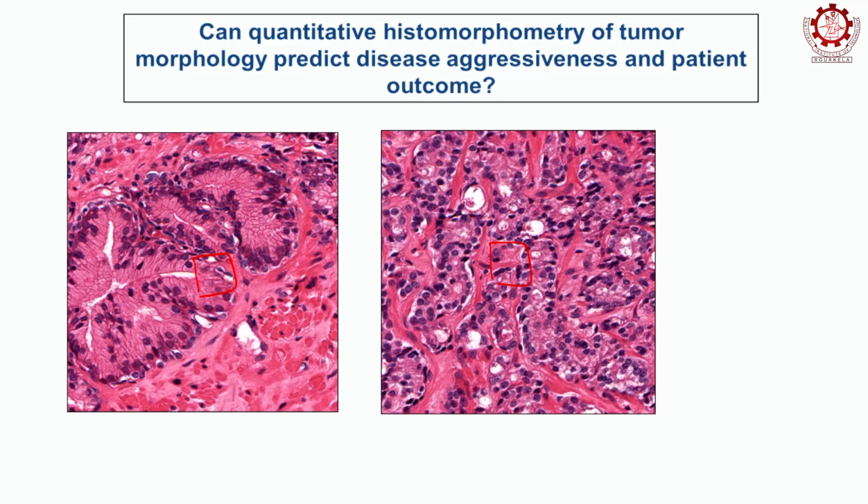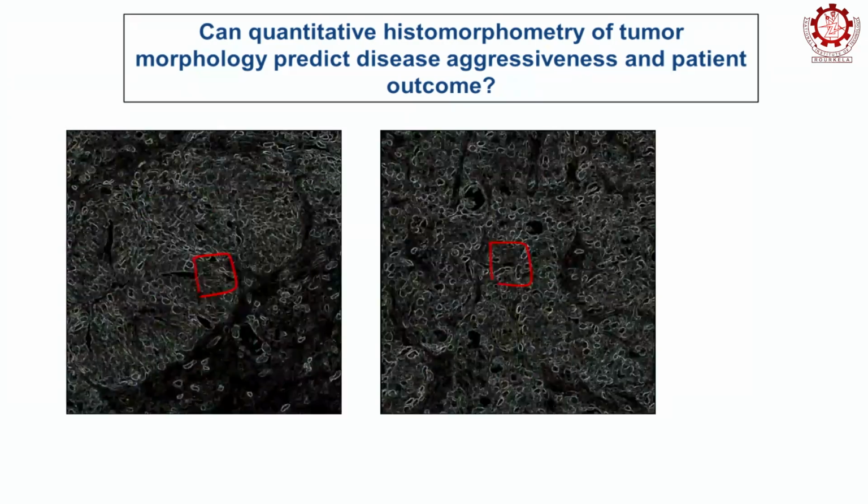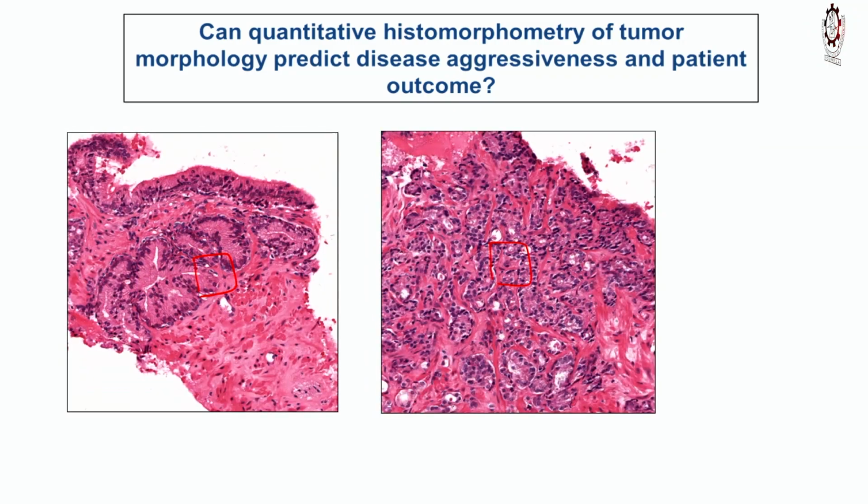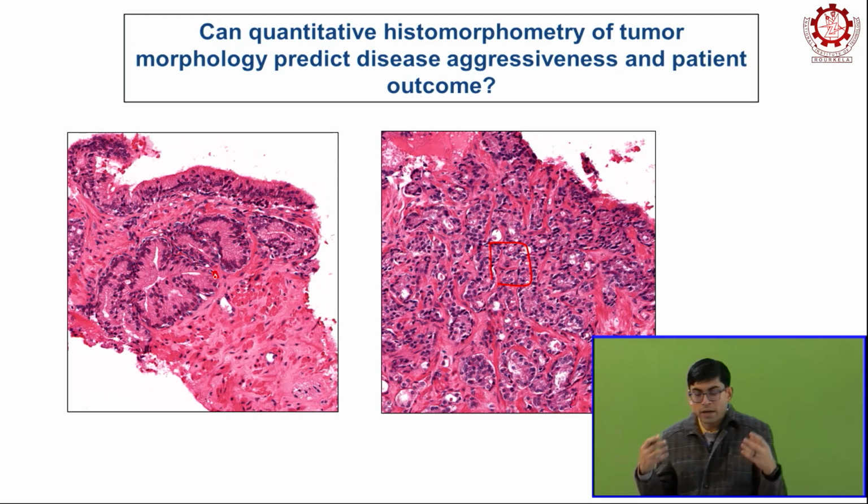We don't stop there. We can further zoom out. We can create graphs. We can look at the intensities, and now you are beginning to see what the whole slide image looks like, right? So that small image that we saw in the beginning of the slide is probably one tiny speck here, right? You see how we are getting more and more context, and this helps us.